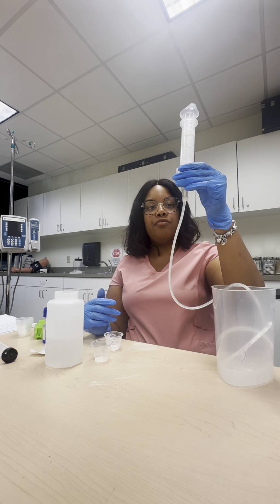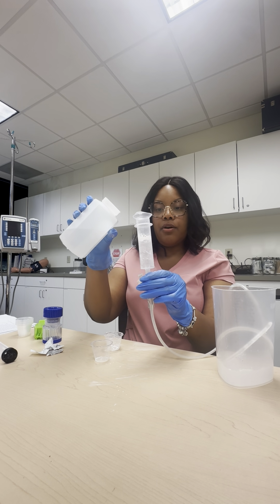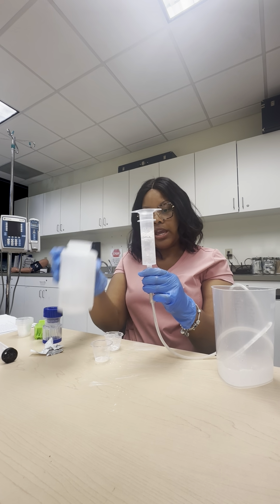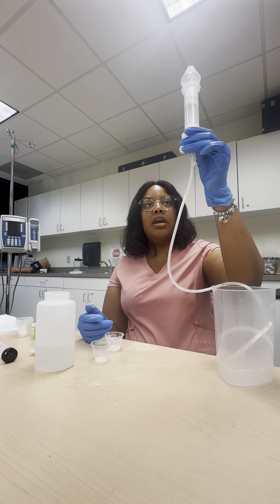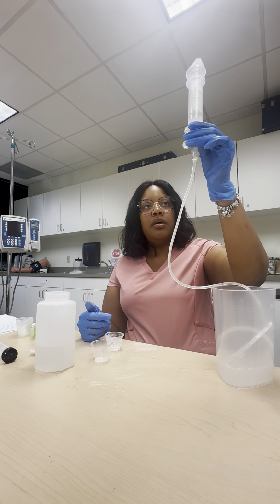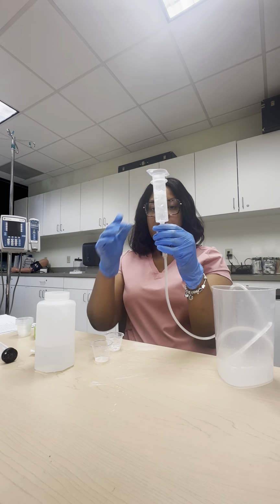All right, so after we've got all the medicine in, we're now going to end with the 30 ml flush. We're going to measure out 30. Remember, your numbers are right here on the side. If you go over a little bit, that's okay, as long as your patient is not on fluid restriction, it's only water. All right, so you just administer medications.